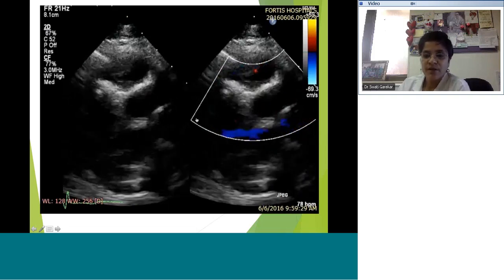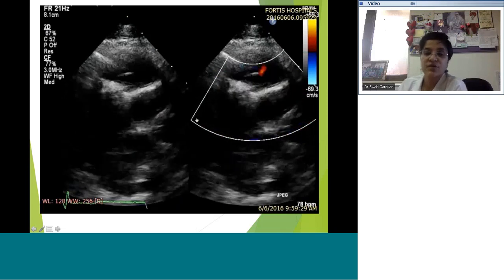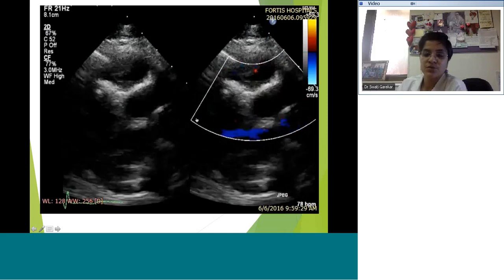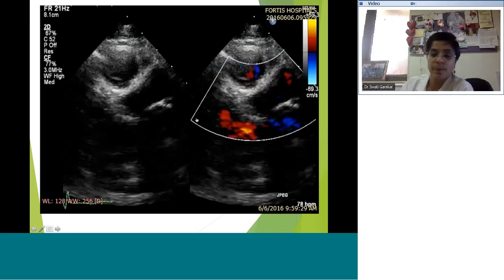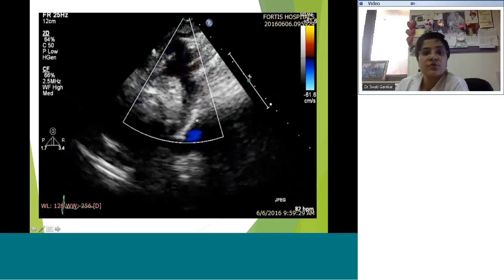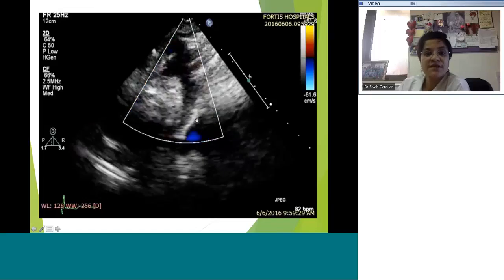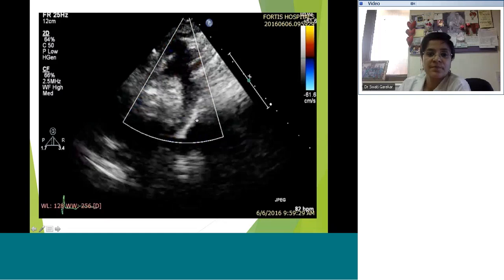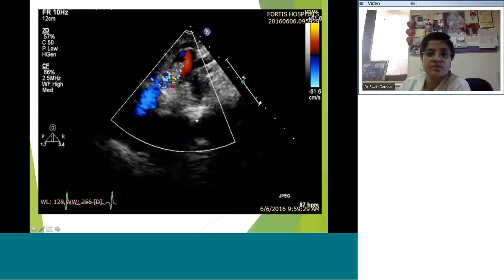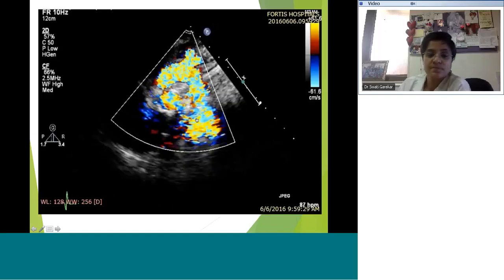All right, so familial hypercholesterolemia is what I asked. What is the link between familial hypercholesterolemia and supravalvar aortic stenosis? That's the question. How do you tie the two together, or do you? So look at this. As is our protocol, we are doing a color Doppler of the descending aorta, and there is flow reversal there. There is also, look at how in the ascending aorta, there is turbulence.